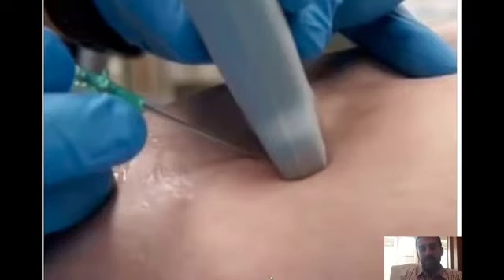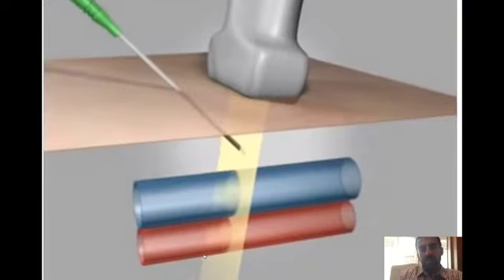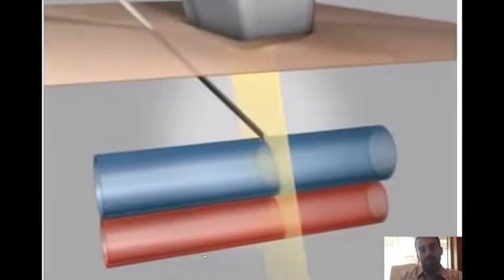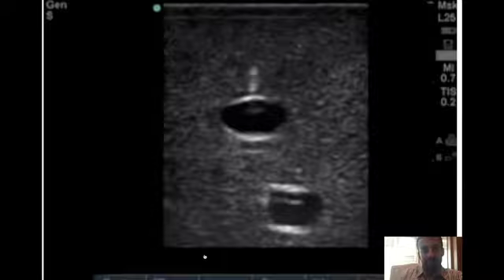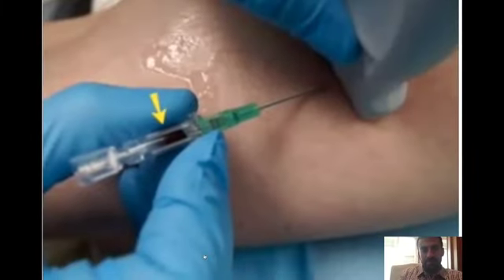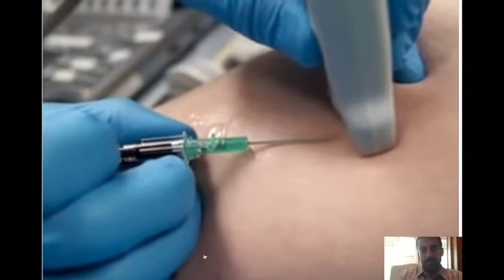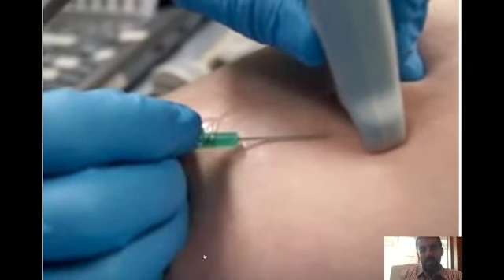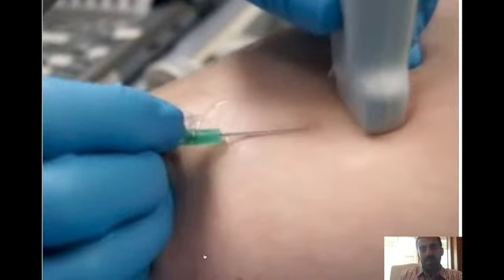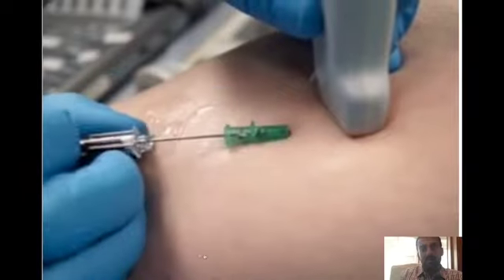That technique of fanning is a very important approach: starting initially vertically and then changing the ultrasound probe such that we're able to fan it into the cannulation is the key component. You can see that here. Once we've gained access, we then go through a similar process of connecting the sheath over. But the fanning technique is very important to practice for deeper peripheral venous access.